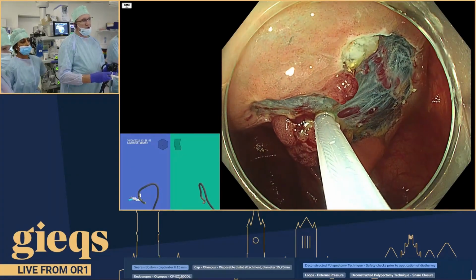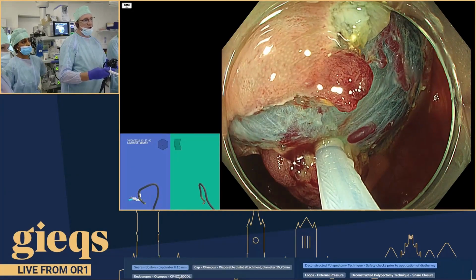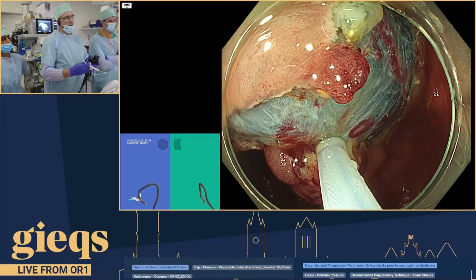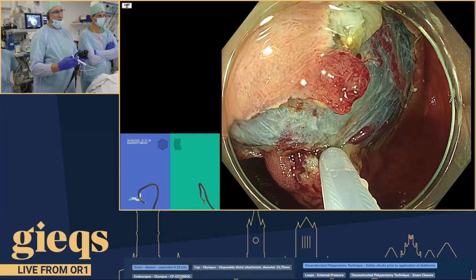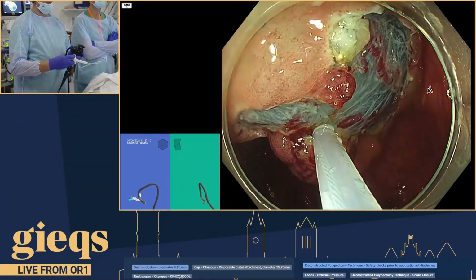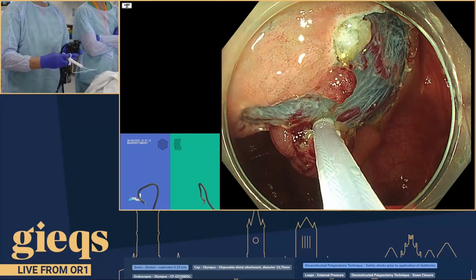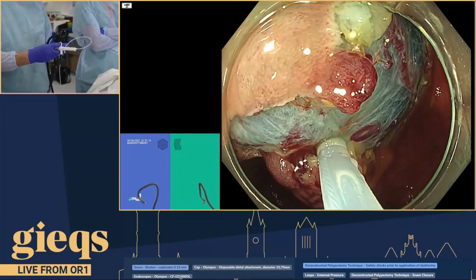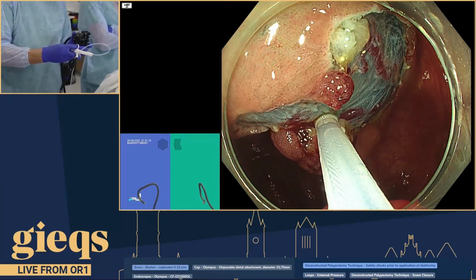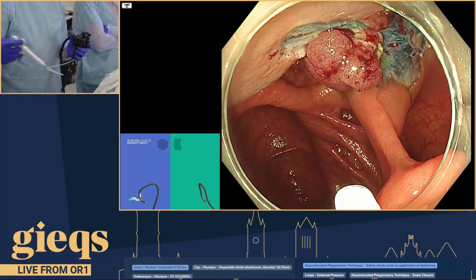So I do all that myself. So watch again. I bring the tissue towards me. I release a little, like so, and then I recapture. Okay, and if there is muscle in there, then we think that should drop it out. And I feel happier now. Look, it moves much more freely. And then it's seated in straight away, so it should be fine.